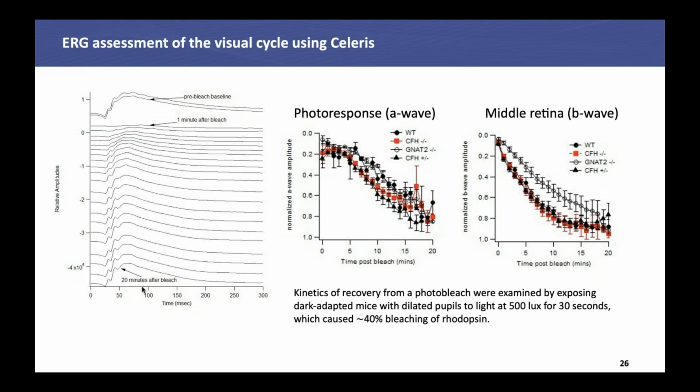It's tricky when you do these bleaches because you have to battle the problem of phototoxic damage to the retina. If you use too much light for too long, then you'll never get recovery. You'll have damaged the retina, and there will never be any recovery. So it's a tricky protocol, and I have some publications on it that will guide you if you need it.